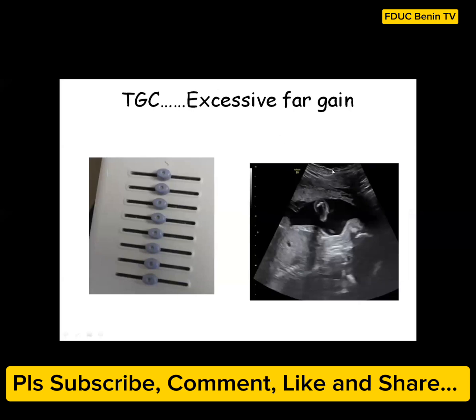So we can now see that this side is too dark. Going down, this depth is so white, so bright, because you have adjusted the TGC knob that corresponds to the lower part here.